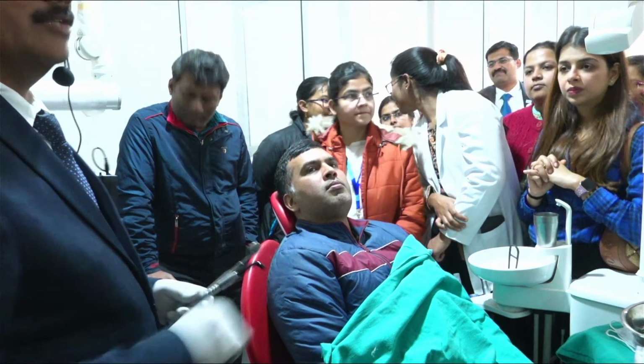Yes. Change. I will show you the tip, and I will show it on the tomato and goat mandible also. Exactly. Nowadays, it is not called hard tissue laser. It is called a dual laser, because it does not have only the function of cutting the hard tissues. It can even cut the soft tissues. You just have to play with the energy levels. Energy delivered, right?